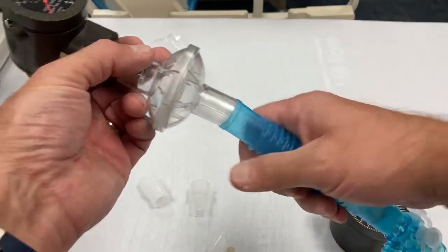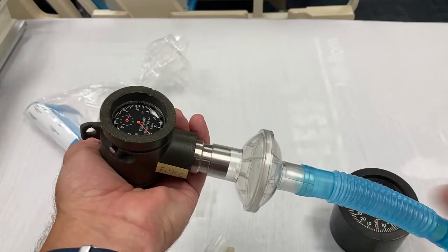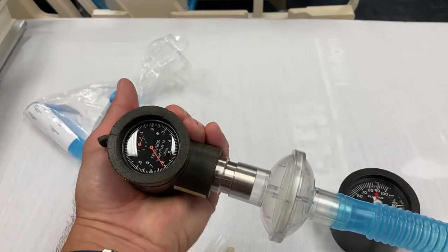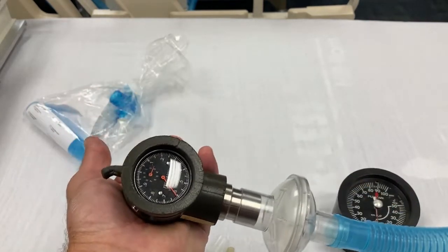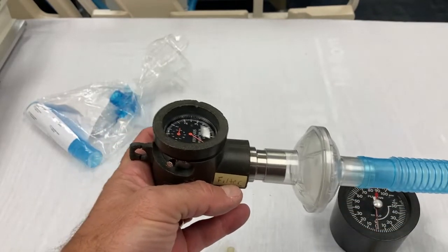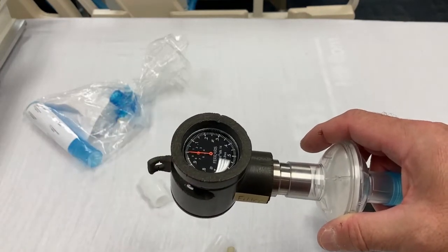But we're going to go ahead and hook it up here. And what you don't want to do is hold the respirometer like this, because that's the exhale side. And if you have it laying in your hand like that, even though it's very comfortable and you can see it, you will block the exhalation and affect the values. So I'm going to hook it to the patient and just tell them to relax, and you're just getting some measurements. And so we're going to hit reset.